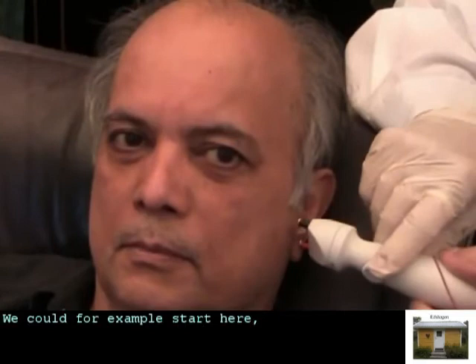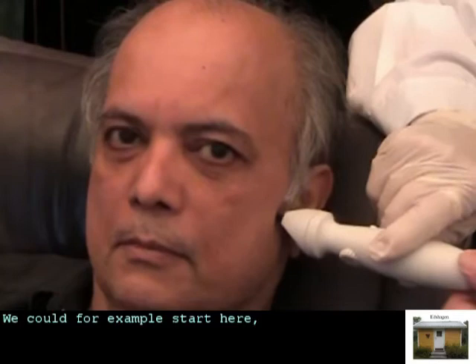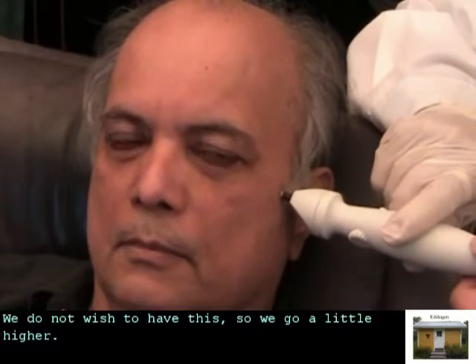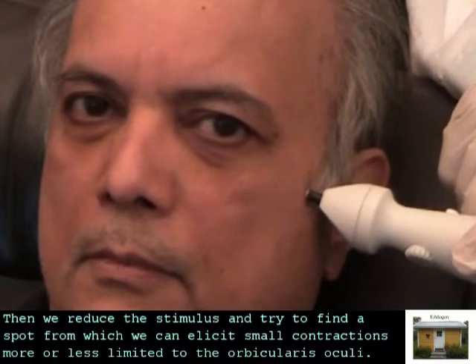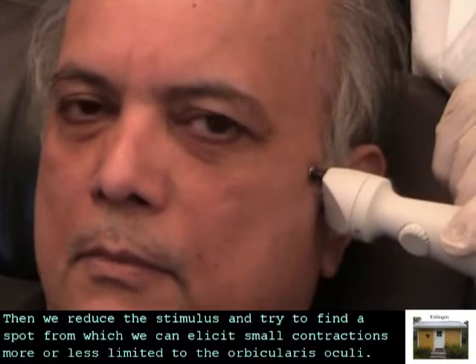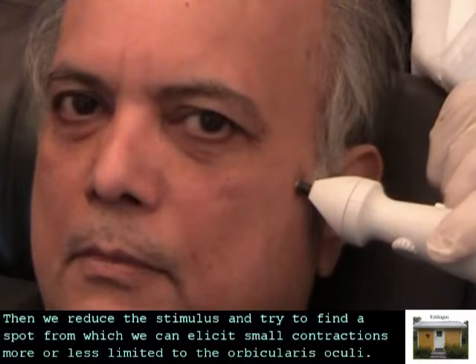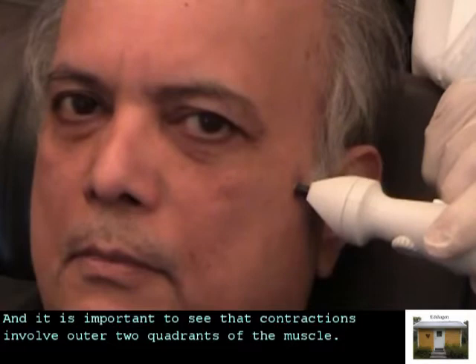We could start here, but this is likely to be a coarse contraction — we see both the lower and upper parts of the face twitching, which we do not wish to have. So we go a little higher; now it is only the upper part of the face. Then we reduce the stimulus and try to find a spot from which we can elicit small contractions, more or less limited to the orbicularis oculi. It is important to see that contractions involve the outer two quadrants of the muscle.